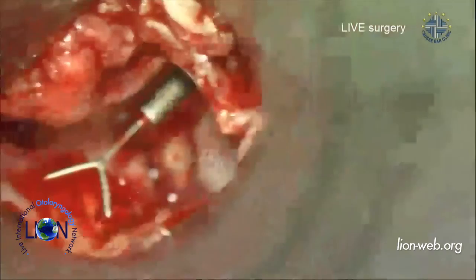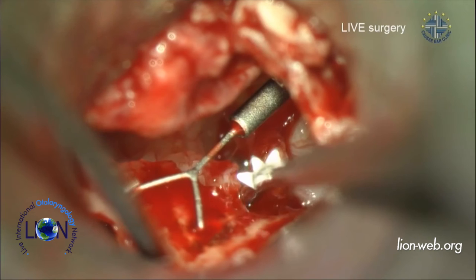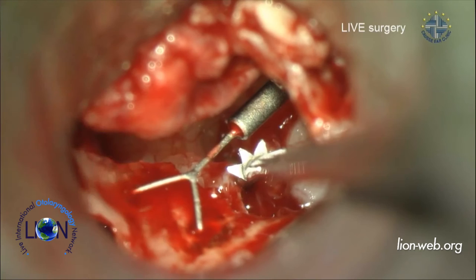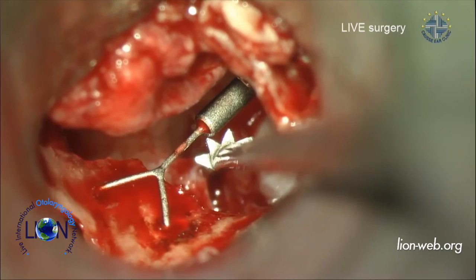Parfait. Okay, the gap. You see the gap between the facial nerve and the superstructure is not that large, but it's good enough. So we've got an elongated stapes measuring rod here. And I'm touching the foot plate. And we are now between the second and the third one, which means 5.6. I will cut it at 6.5. 6.5 should be the right length. Okay. All right.